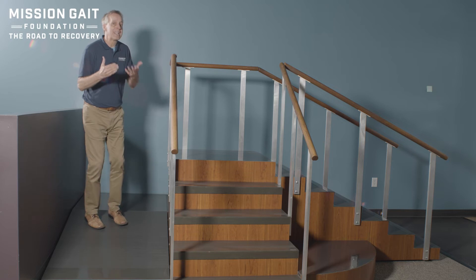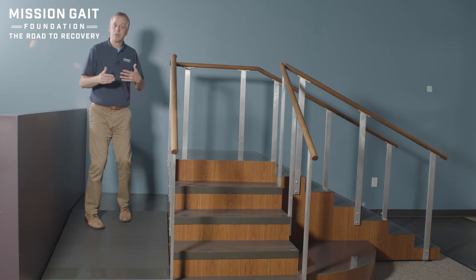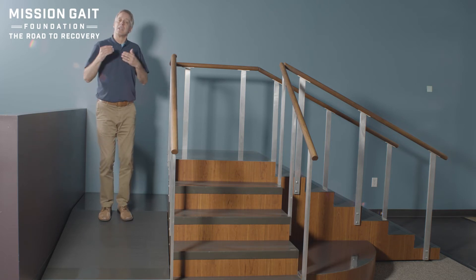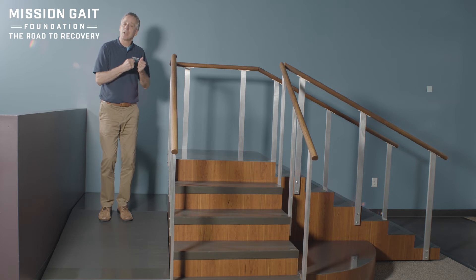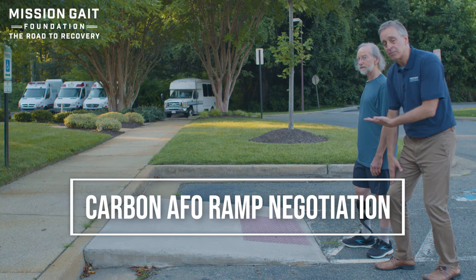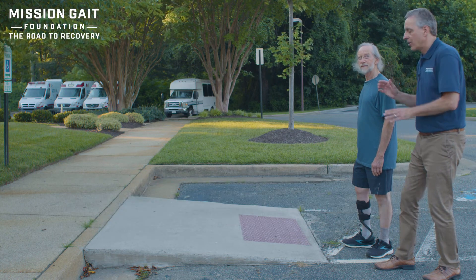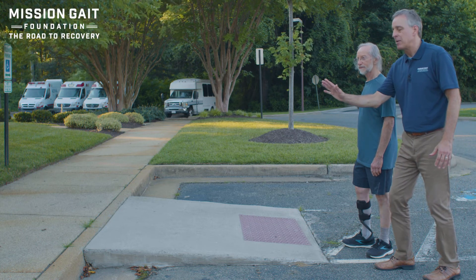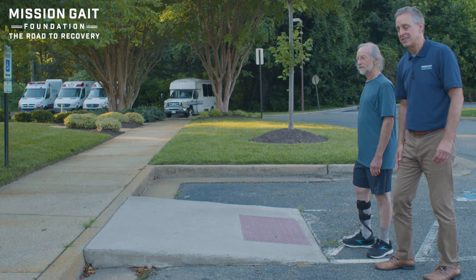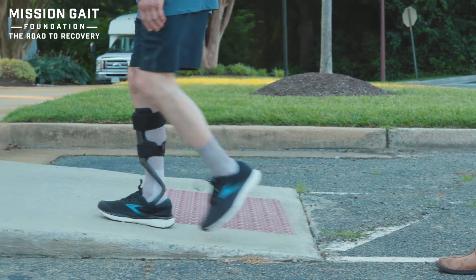Going up that hill, you want to lean into it, keep your weight forward. Let the stability of the knee help you — versus going down, that knee wants to unlock. So stability and power going up, control coming down. The leg is going to give great stability when going up the ramp, but it's also going to tend to push back down the hill. So as you come to a ramp, lean into it a little bit, keep your shoulders or weight a little bit forward. The steeper the ramp, the more you need to lean forward.